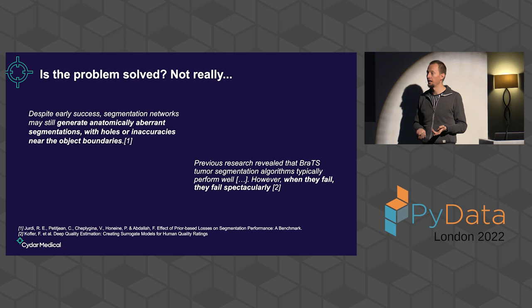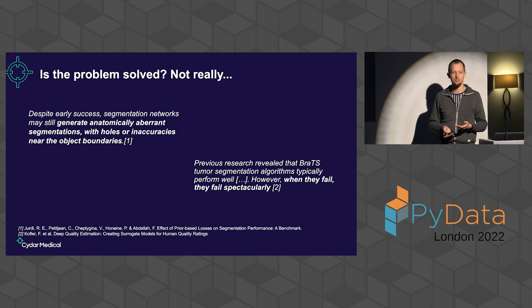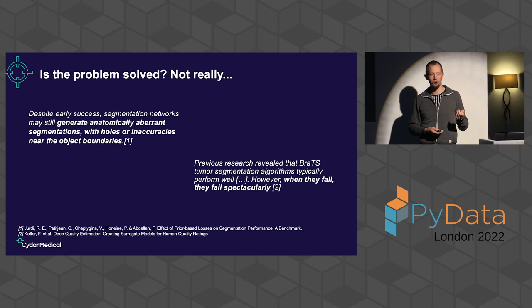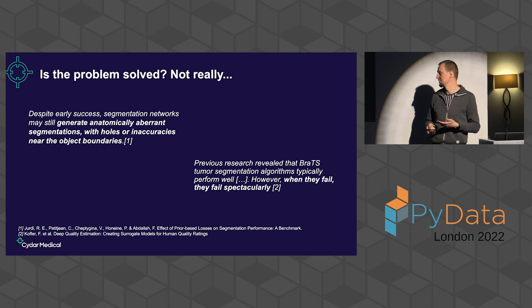Well, not really. Here I show two quotes from some of the papers that still found that although in an overall quantitative way they show quite good results, these models still seem to generate anatomically implausible results, which is not what we want, especially in this scenario.